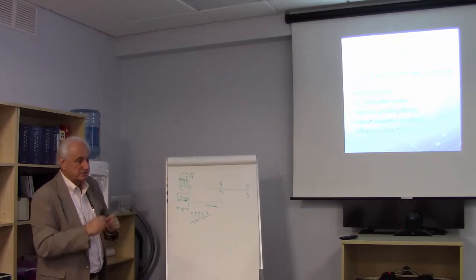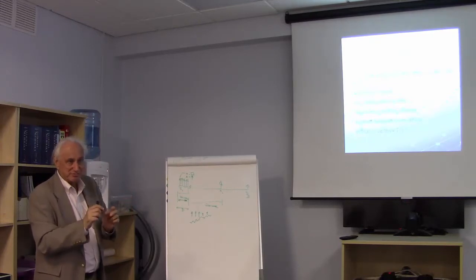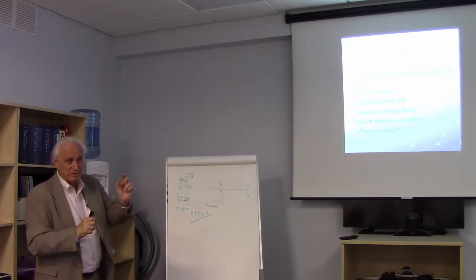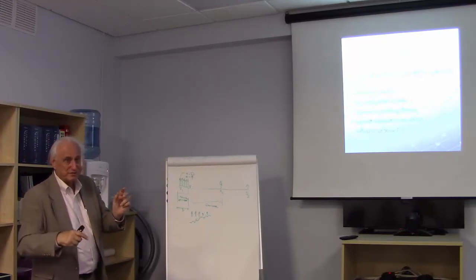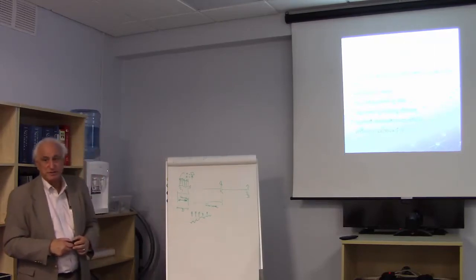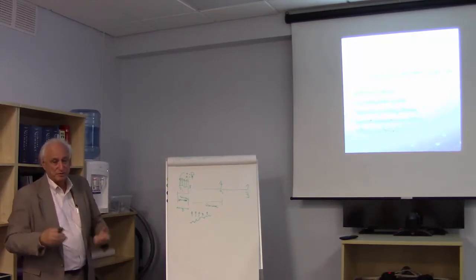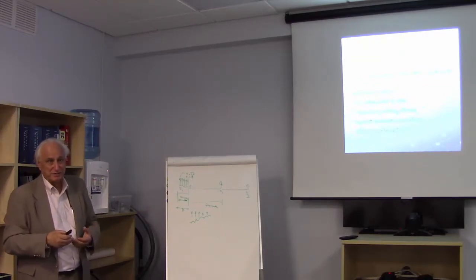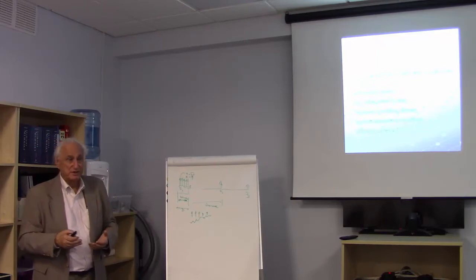Right-left distinction is difficult. I like these grids because if you know what you're stimulating, you'll see a response. Obviously, from the recording itself, you can't tell, but the fact that you know which side your stimulation is being applied to infers which side the response is coming from. And I made the point, very difficult to use below T10, just because you don't have a volume of tissue that's producing a signal. Now that can easily change as sensitivity becomes better in the kinds of equipment that we have.